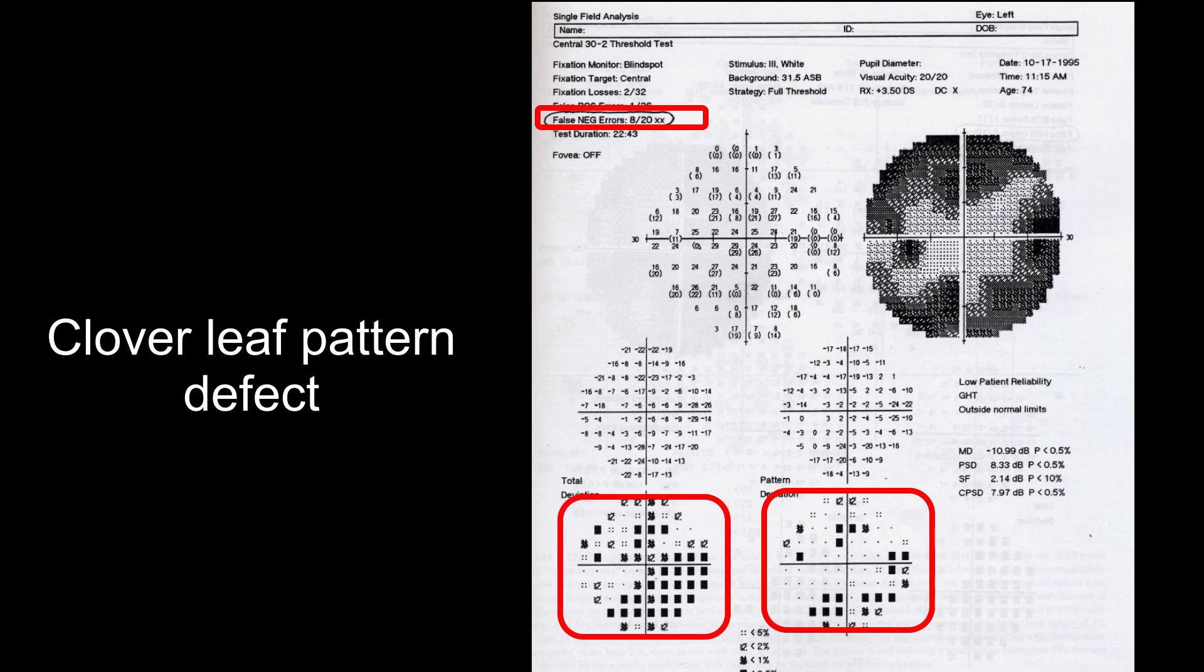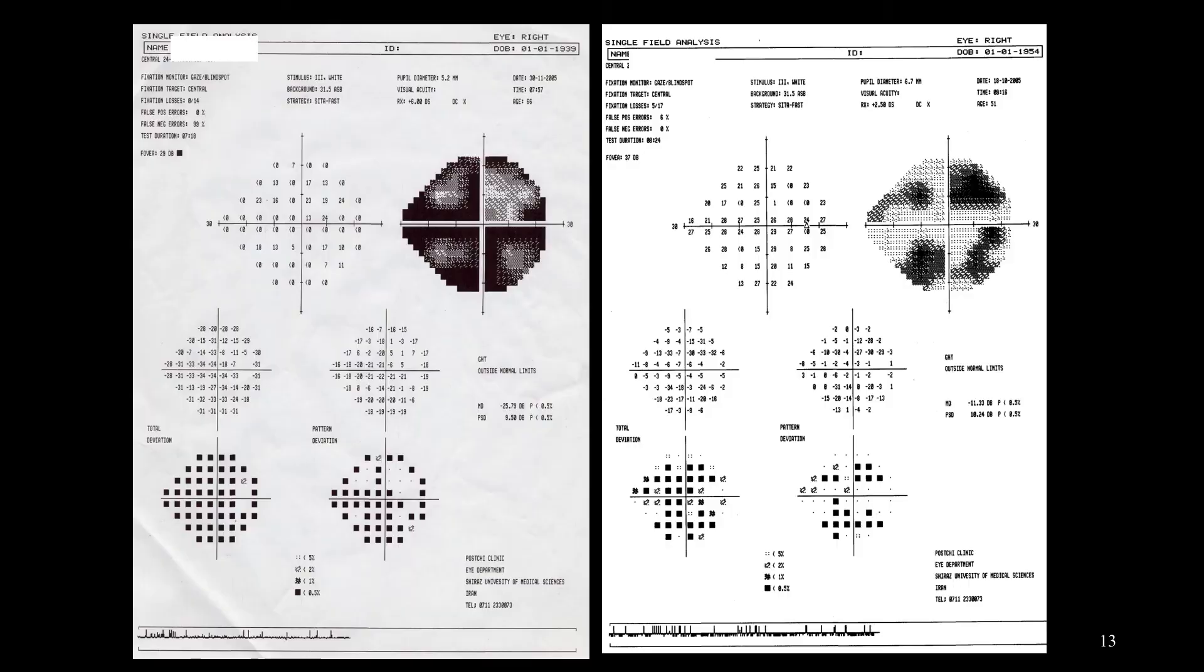We have a darker total deviation compared to the pattern deviation. We get low reliability message, the GHT is outside normal limits, the mean deviation has negative value and abnormal PSD.